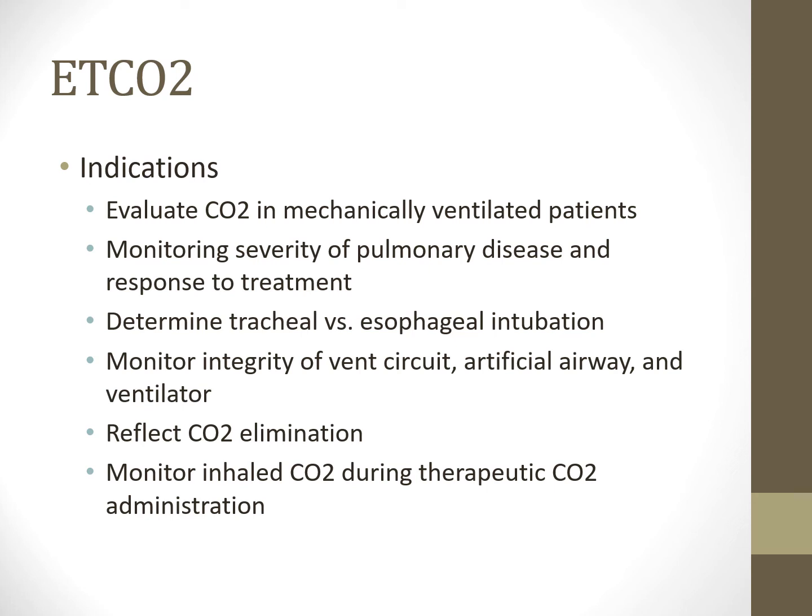It's also a great way to see if their hemodynamics, their ventilation, and their compliance are getting better or worse. It can give you a better total picture of this patient. So end-tidal CO2 in mechanically ventilated patients, I think, is an invaluable resource, and it's very important that you understand how important it is, what this means, and what could cause it to be off.